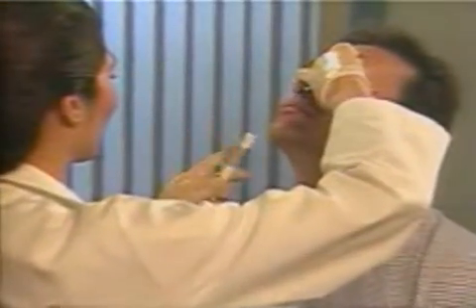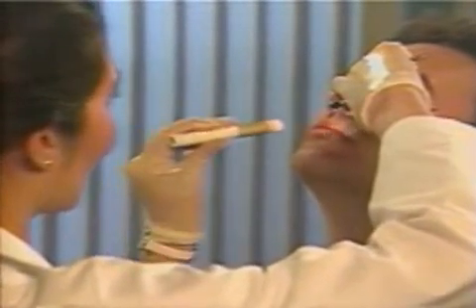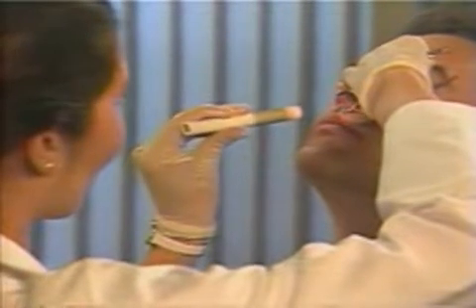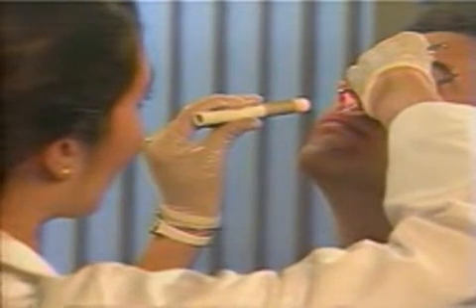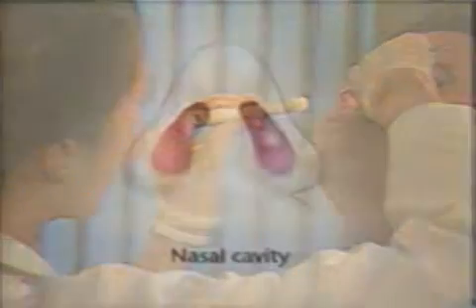Dominant hand with the blades closed. Insert it about 1 centimeter into the vestibule. Keep the blades vertical and stabilize yourself by placing your index finger on the tip of the nose. Shine the pen light with your non-dominant hand as you gently open the speculum blades.